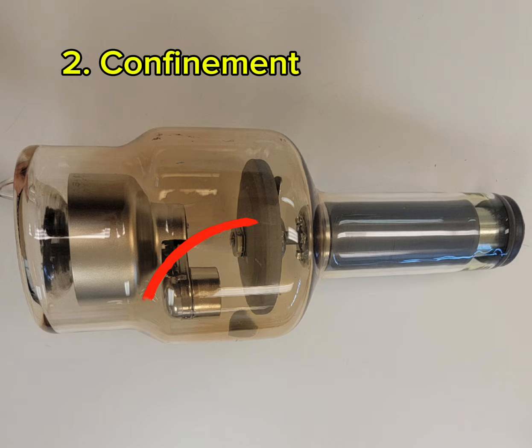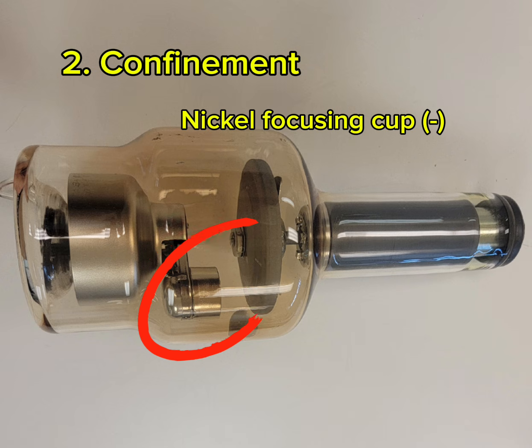Step 2 is going to be confinement. Surrounding the two tungsten filaments is going to be a nickel focusing cup. Why nickel? Because it's negative, and the electrons being produced by those filaments are also negative, so it therefore confines them into a more narrow electron space cloud.